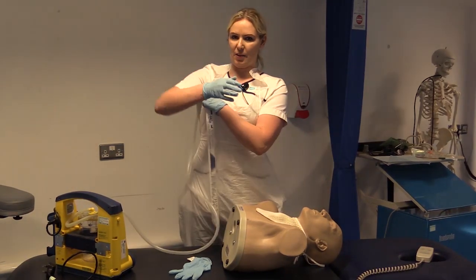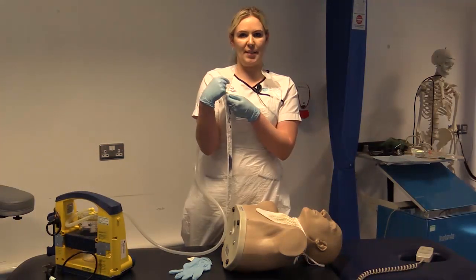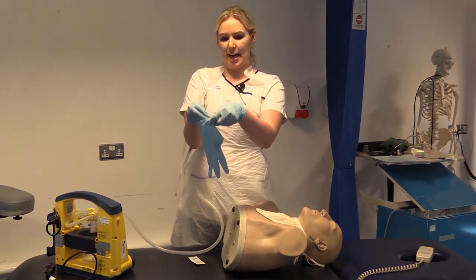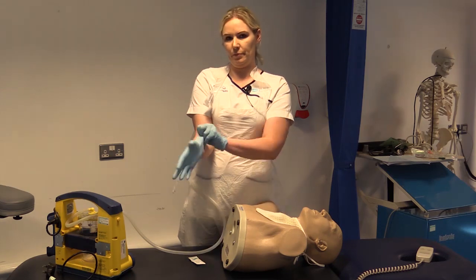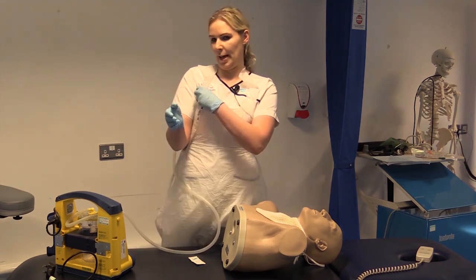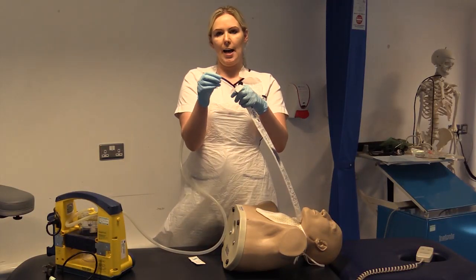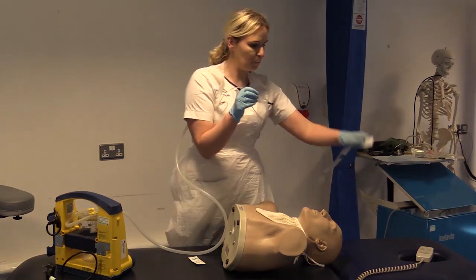You're going to pop that in underneath your arm, and on the inside of the plastic sleeve there you can add some lubricating jelly just to lubricate the tip of the catheter before you insert it. Okay, at this point then we're going to add our second glove, and this is just for your clean hand, and this is the only hand that should touch the catheter. Okay, so you're going to turn on your suction. Okay, and you're going to slowly remove your plastic sleeve, making sure your clean hand is the only hand that touches the catheter. And as you come out, you're going to lubricate the tip of your catheter with some gel.